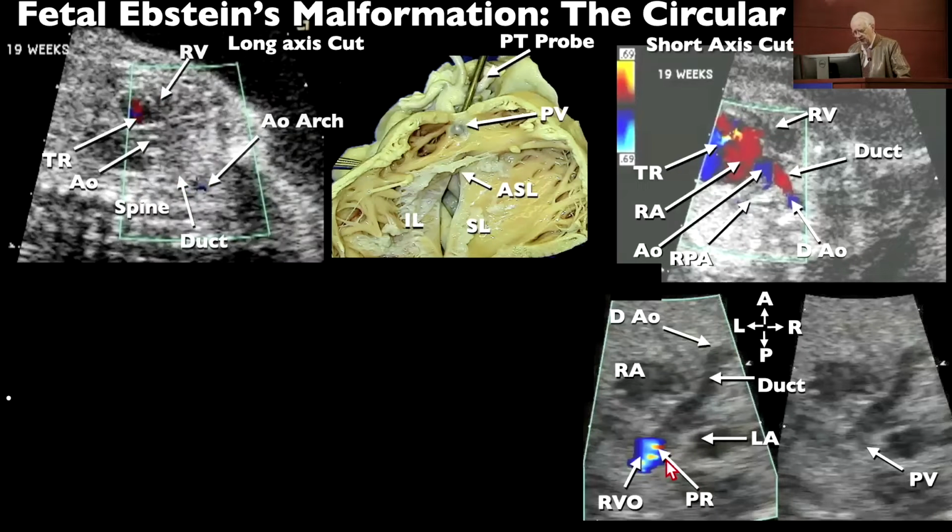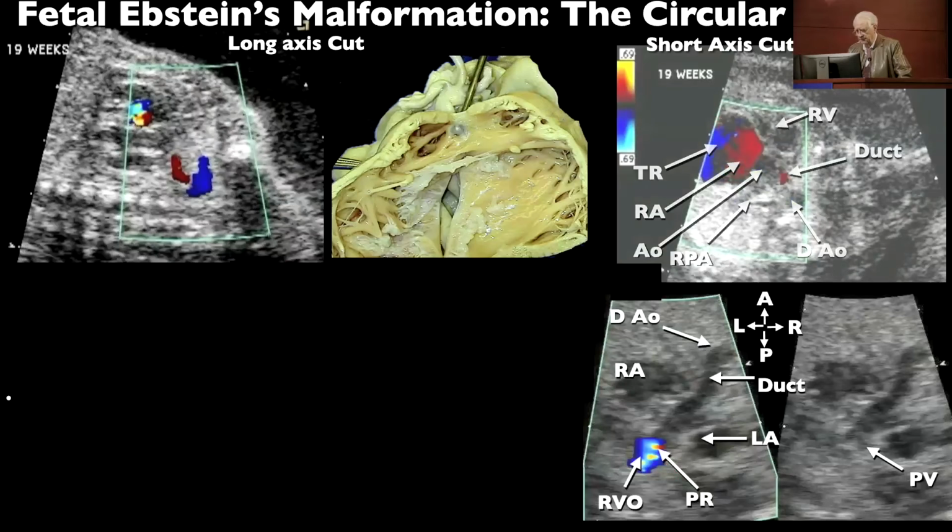This is going backwards. I don't know what's going on with this machine.